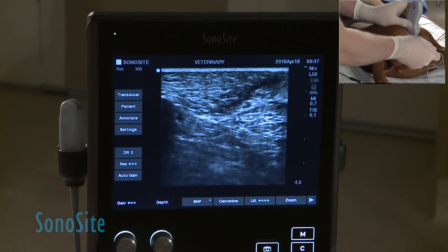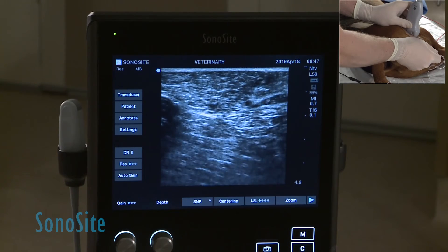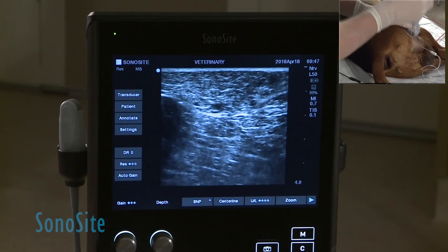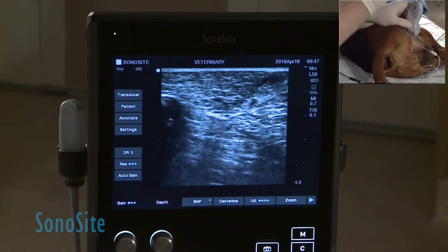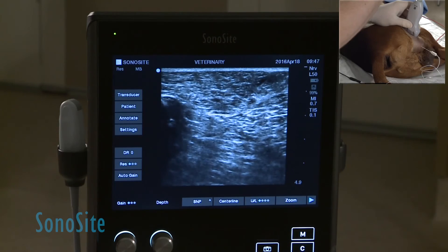You can see the anechoic black volume spreading around the nerve, deep to it. Once we get good spread underneath the nerve, we usually pull the needle back slightly and use the local anesthetic to dissect between the nerve and the fascia that lies underneath the biceps femoris.